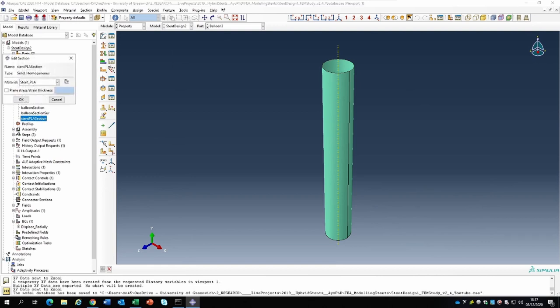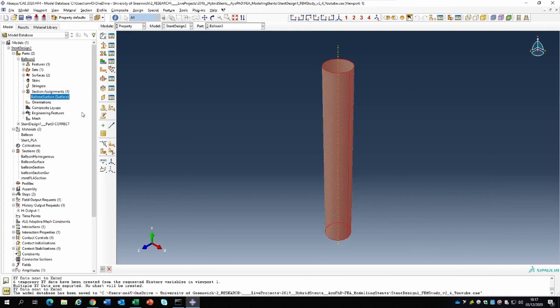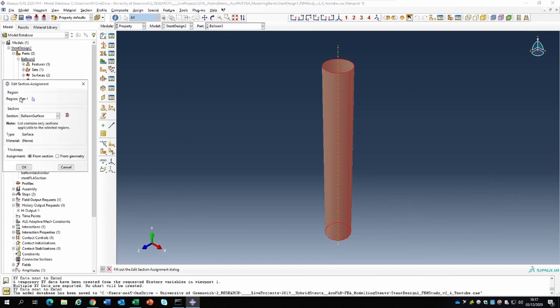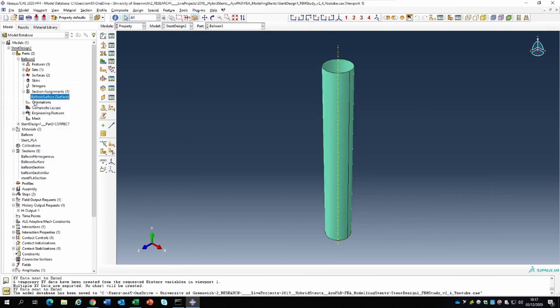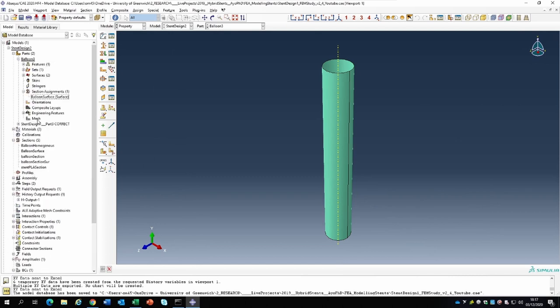We created sections. For the stent it was modeled as a continuous solid homogeneous material. The balloon is a very thin membrane element - you can model it as a surface element, shell element, or similar. The actual section assignment we used treated the balloon as a surface element, because it's essentially a surface element.